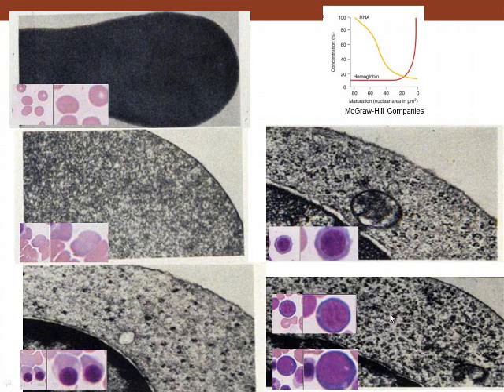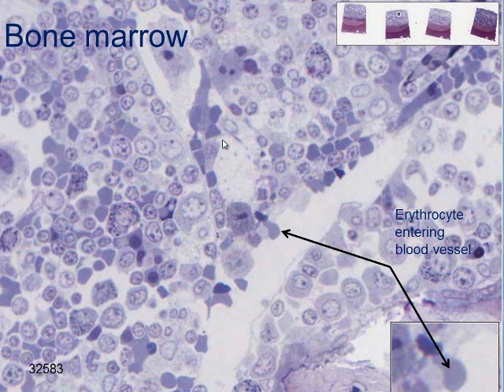And then the basophilic normoblast is going to have a lot of ribosomes, hence that blue cytoplasm, and a very euchromatic nucleus. So what's changing is it has a nucleus in the immature form, and the nucleus becomes darkened before it's ultimately removed. And here we can see a scale. This is the amount of RNA, so there's RNA in these ribosomes, getting less and less as you go, and then as maturation proceeds you get more hemoglobin. So as you get more hemoglobin, it gets more red and less blue, and that's basically what we're seeing.